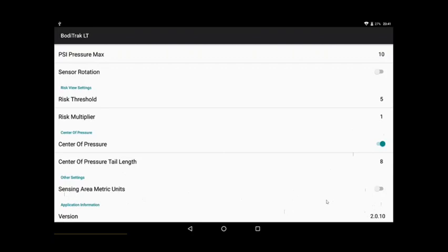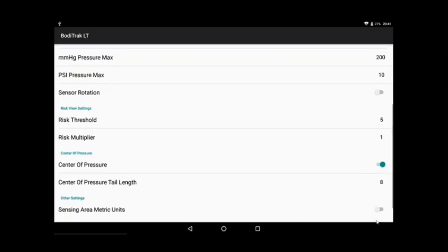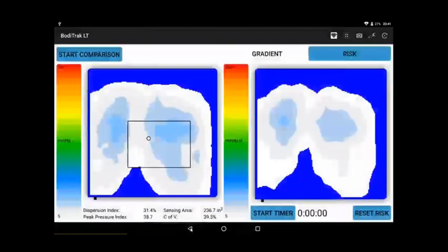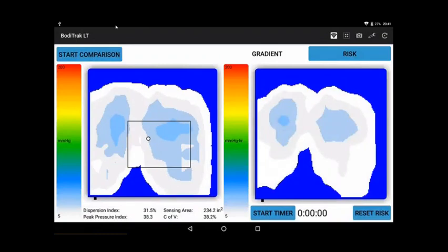Sensing area in metric if you want. Europeans like that, of course. The rest of the world, actually, other than the US. And then version of the software you're using on the tablet. So that's a very quick overview of the Android BodyTrack Lite software.